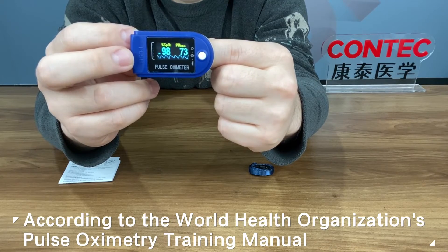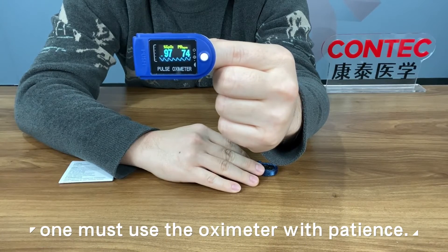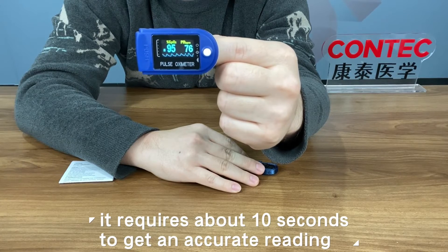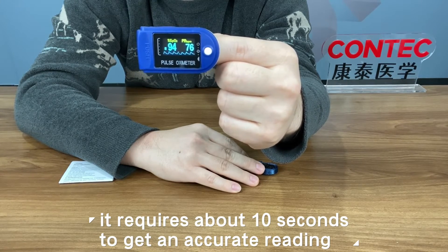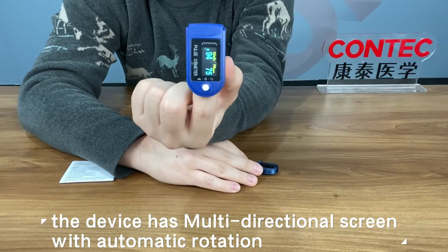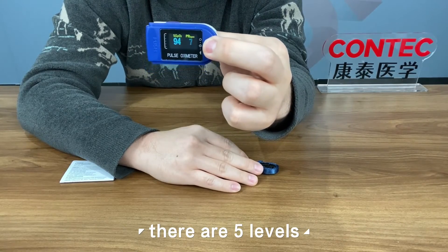According to the World Health Organization's pulse oximetry training manual, one must use the oximeter with patience. Once clipped on, it requires about 10 seconds to get an accurate reading. The device has a multi-directional screen with automatic rotation, and you can adjust the brightness with the button — there are five levels.